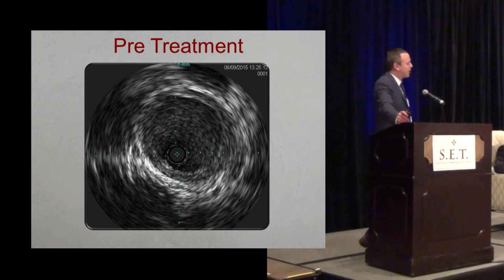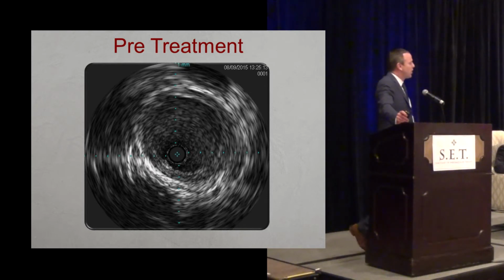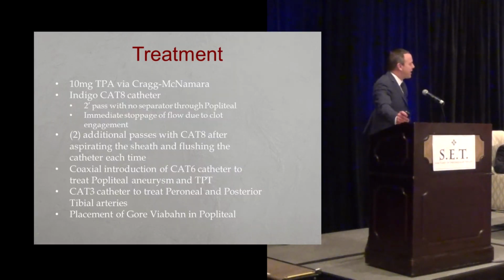utilizing these in a coaxial segment, utilizing the Cat 8, the Cat 6, and the Cat 3. All those will go through each other. We create a channel. Now, we're certainly not trying to get all that clot out of there, but we're going to treat that then with a Viabahn. So this is sort of the treatment algorithm, as I just stated. Did use some lytics in this case.